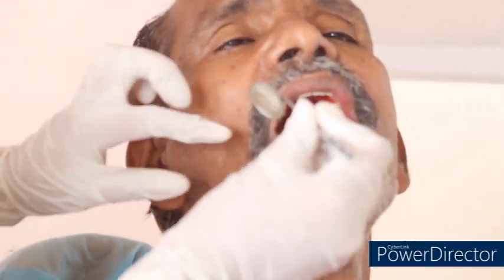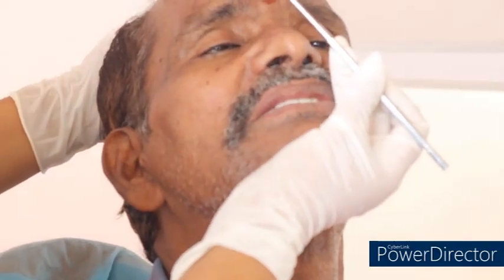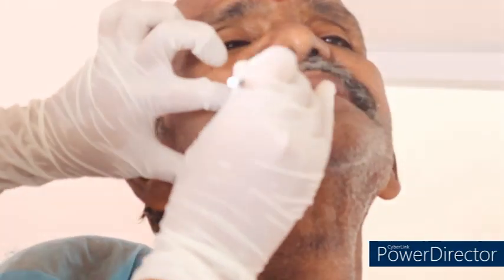Similarly, you have to check the right side also. This can be visualized with the mouth mirror. So all the posterior teeth are in simultaneous contact.